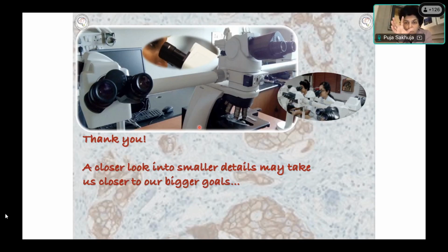So you have to realize that sometimes they are red herrings, and you will never know that that is a red herring. What is a red herring? It's just pointing you in the wrong direction. Okay. So that's why it is very important to look at a biopsy in total to make sure that you are not just seeing one thing and not identifying the other, because in that particular case, there was an active colitis amoeba, but it's only because you're looking carefully at a biopsy that you realize that there is that fuzzy border also, and we should look for spirochetes also.